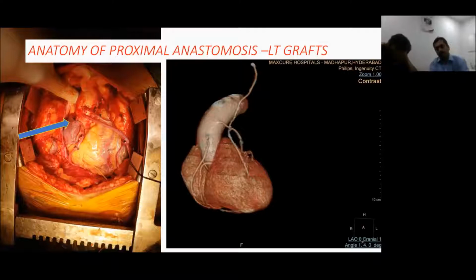Yeah, that's a very good question. You might be afraid that you might unravel the anastomosis or cause some bleed, but no, that doesn't happen. Very unlikely, unless you are so crude as to do that. It's a simple thing. What I would suggest is, with your own catheter, whatever catheter you want to engage with, at the distance at which you are working, push on your finger and see how much pressure you can exert. It's a simple test. You can see, with the gloved hand.